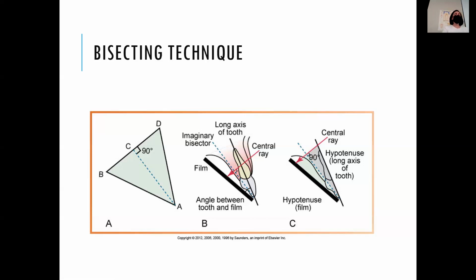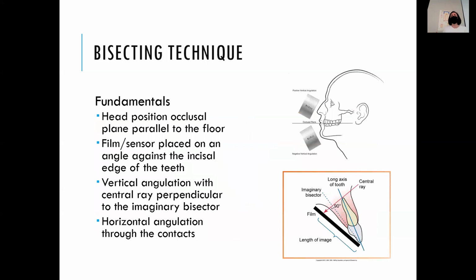I know. It's not that bad, actually. When we do it in lab, it's actually not that bad. It's a confusing thing to think about in the beginning, but it actually is okay, really. Trust me. Okay, so bisecting technique.